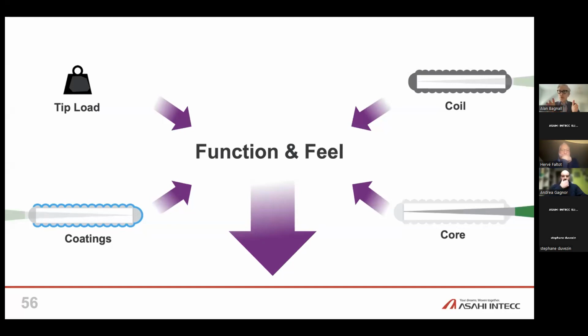So we're moving away from that idea of having a favorite wire, the one that your boss used, the ones that you've always used, to coming down to a concept of specific wires with specific properties that you know about that you will apply to overcome very specific problems.